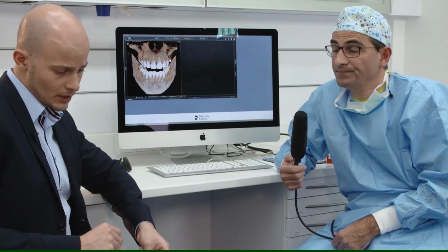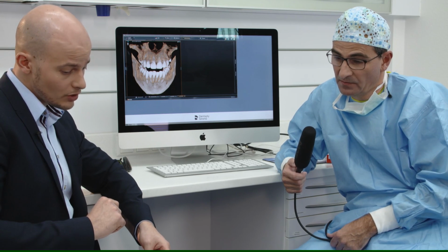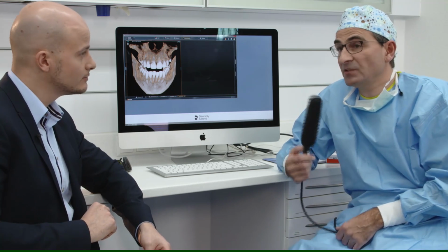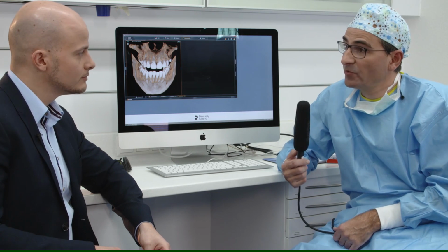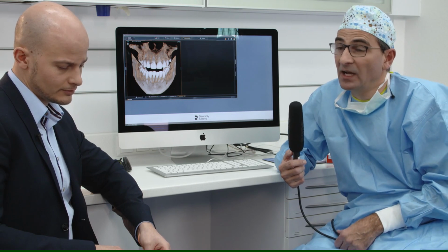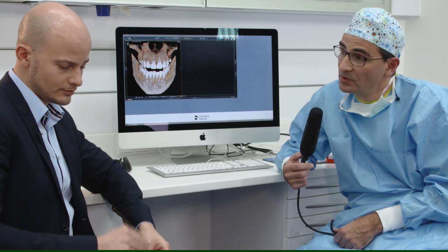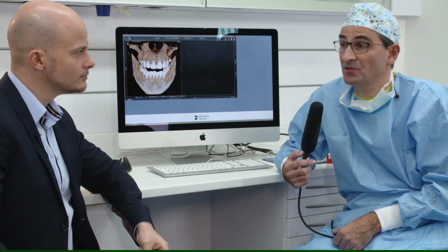Another question is, do you always use the digital workflow for implantology, and if yes, why? That means if you always use CEREC or a cone beam, I would say definitely yes to both. Because I get my backward planning from CEREC, and I have a perfect view into the bone when I do my cone beam. So we don't make any implant without 3D diagnostics. Definitely.